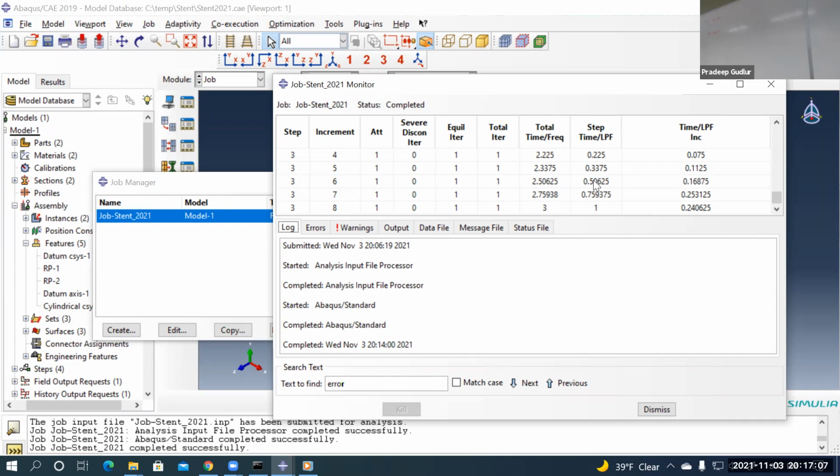There's some penetration, that's the overclosure. If there was some penetration during the assembly, that's what I was asking you to adjust, the overclosure. So that the stent doesn't pierce the balloon. Yeah, so we should.